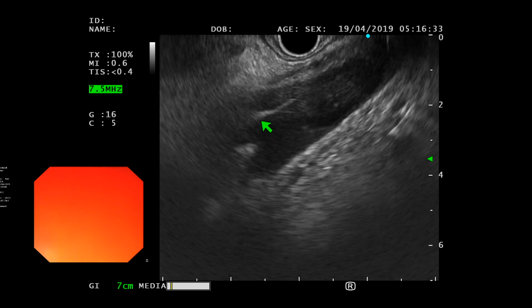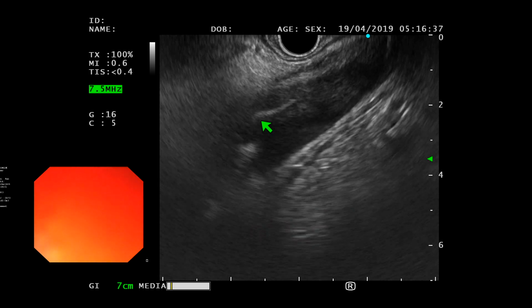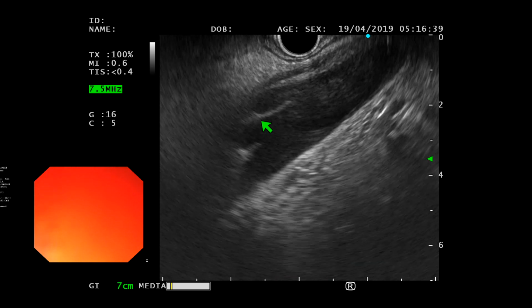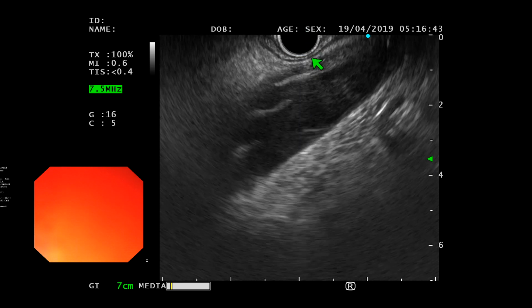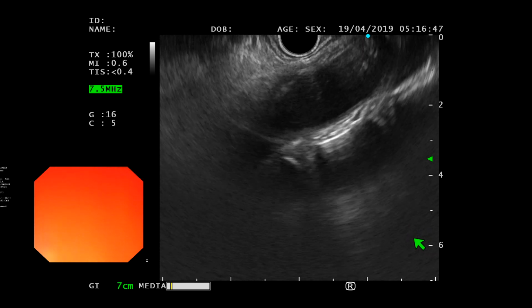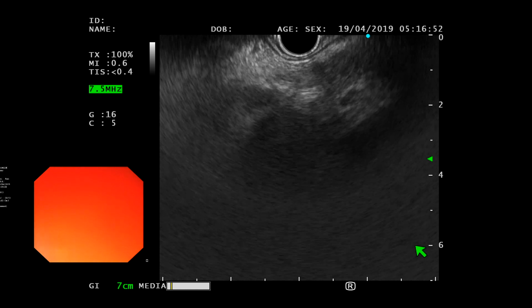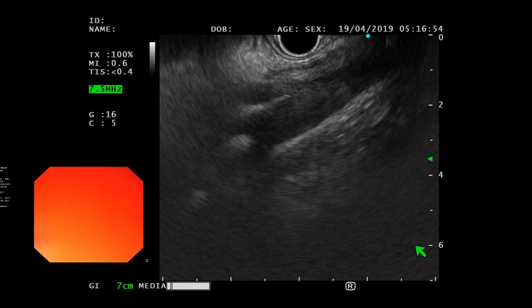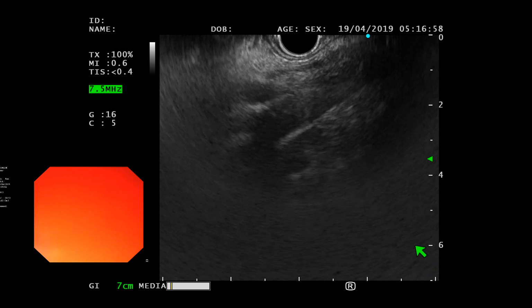Okay, happy with that now? Yeah. Achha, I know we've achieved. I just want you to do another step, if you can, for me, please. So this is your tip of the scope. I want the pancreas to come here. Okay? So therefore, don't do anything until we talk about it. We haven't discussed that station yet. So the next stage of this is 2 to 3 centimeter of the scope push.